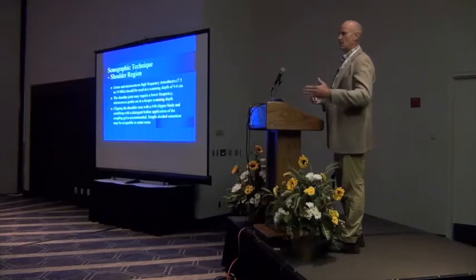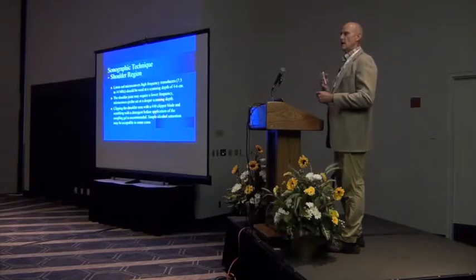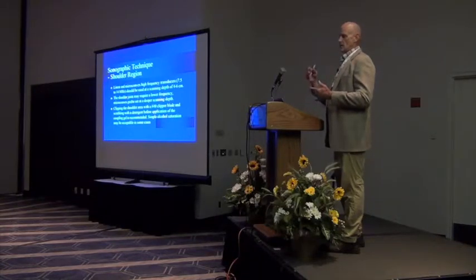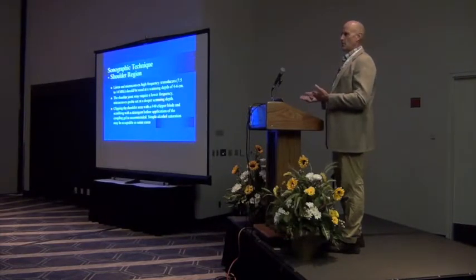So if I scan it when I first see it, and I say now he's on a 60-day recheck program, I'm comparing apples to oranges. I never knew what the actual lesion size was. Okay, so I've got an initial scan, I come back in 2 or 3 weeks, scan it again, and now I'm scanning it every 60 days. Well, I'll also add on top of that, we're going to do interventional, probably treatments of some sort nowadays.